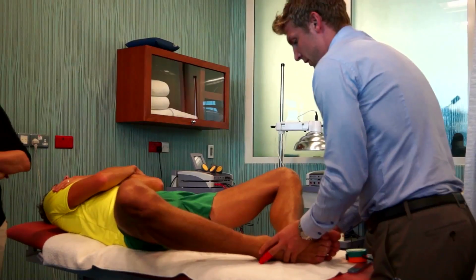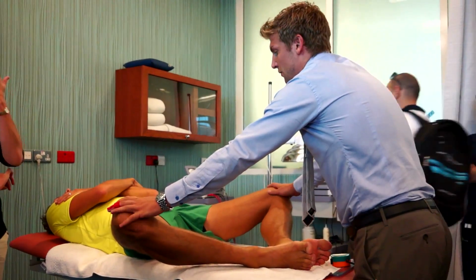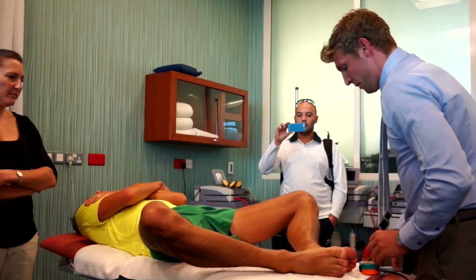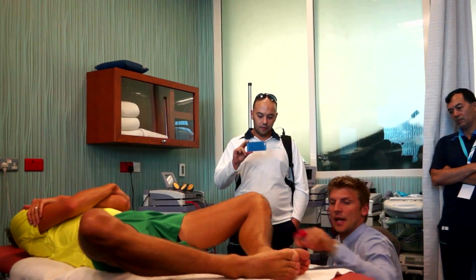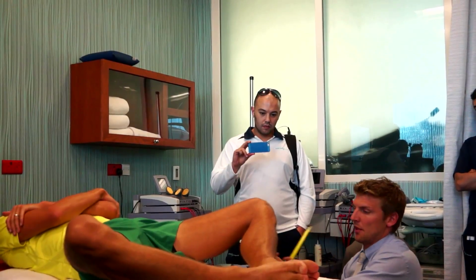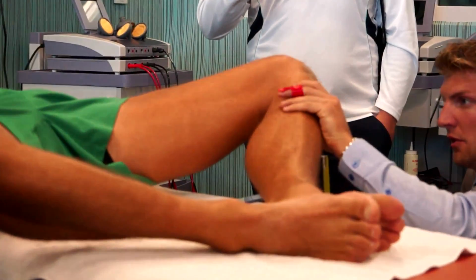Get the heels together again, make sure they're the same distance, and do a gentle overpressure here to make sure that he's fully relaxed in the muscles around here. Then what we're measuring is from the head of the fibula out here on the side, and because he has quite long legs and a narrow bed, we're going to use something to extend the bed here, so we get a straight measure out here that's easier to do.